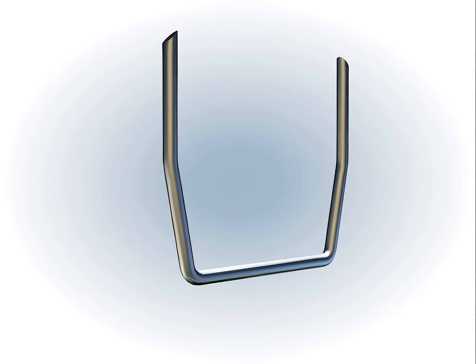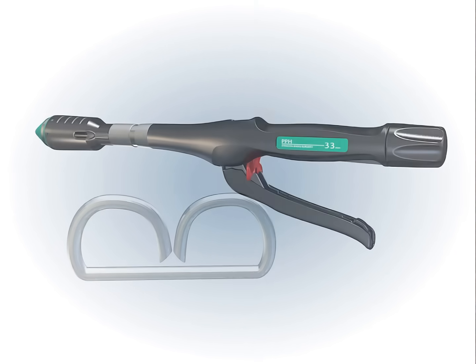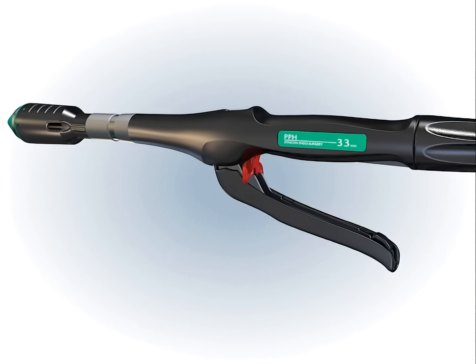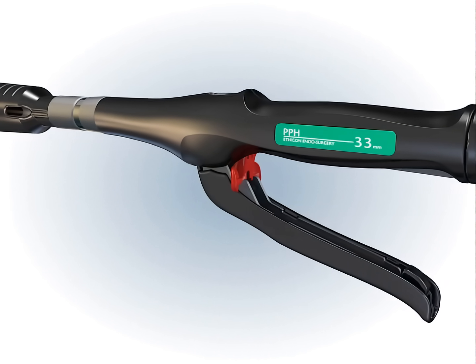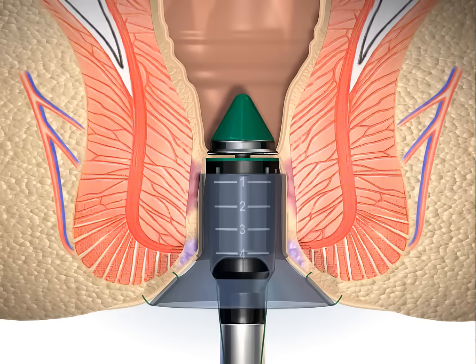Tighter staple compression may reduce risk of bleeding from the staple line. Be certain not to touch the safety until the device is ready to fire. Release the safety and fire in one fluid motion. Keeping the stapler fully closed for approximately 30 seconds before firing and approximately 20 seconds after firing acts as a tamponade, which may help promote hemostasis.